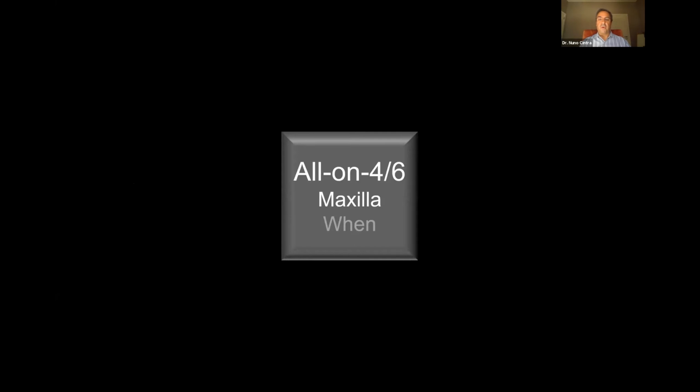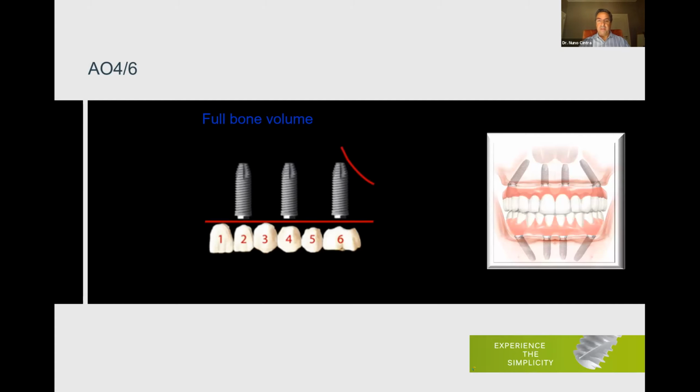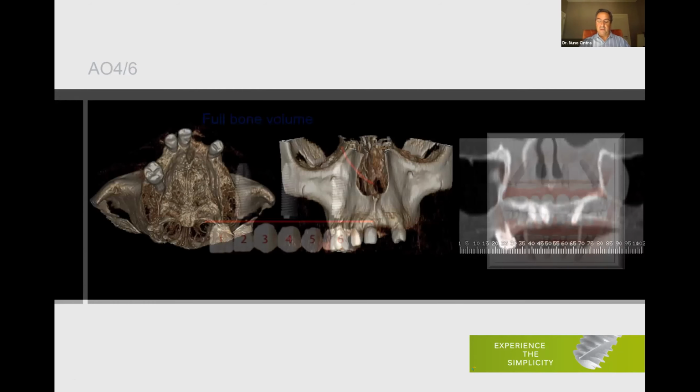When do we do all-on-4 or all-on-6 in the maxilla? Let's start with the maxilla. Well, if we have full bone volume, meaning that our posterior implant will come out on the 6, or even on the 7, if we have that amount of bone available, we think about all-on-6, because this one is coming out either on the 6 or 7. So we have no cantilever or one tooth in cantilever. That's not very common, but when we have full bone volume, we can go for it.